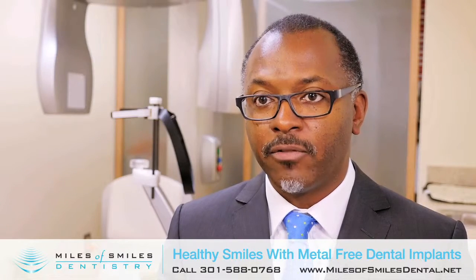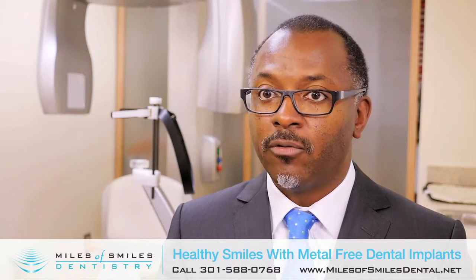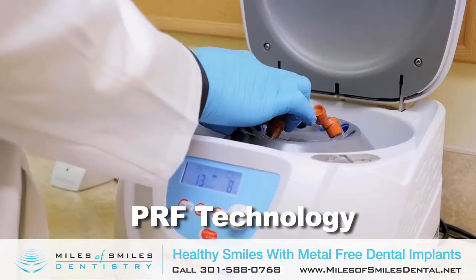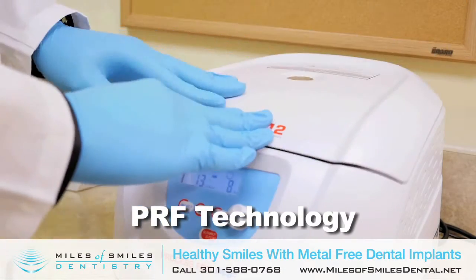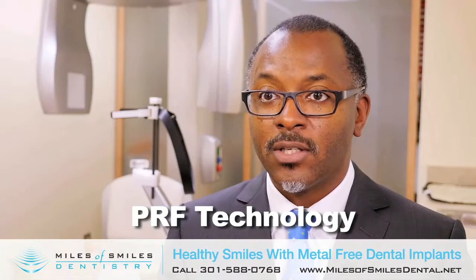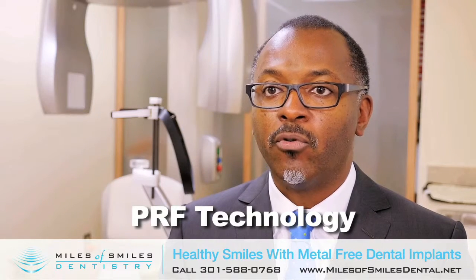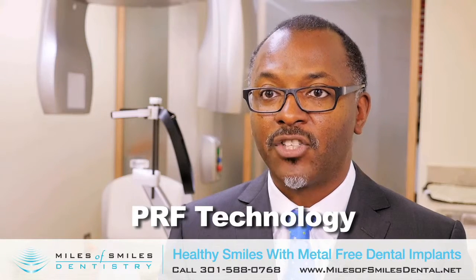Things change very quickly in implantology like in other fields. For example, recently we have adopted the use of PRF, which is a technology where we can harvest the patient's blood, spin it, and use it back in their body to improve healing, to improve bone, to improve the amount of gum they have if they're deficient in that sense.